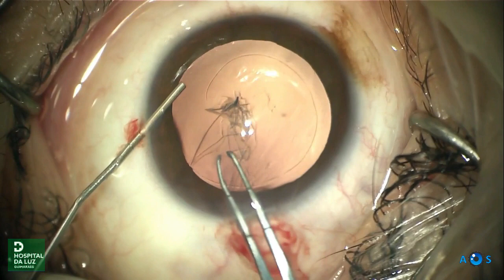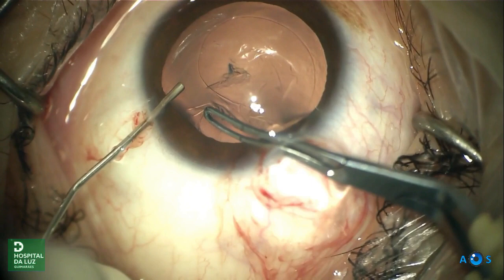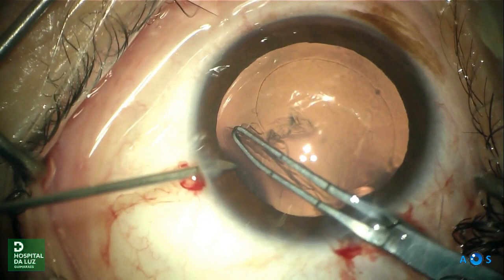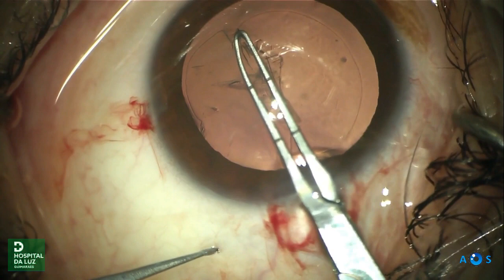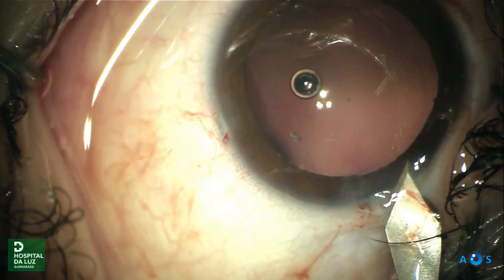Due to the anterior capsule elasticity, during capsulorhexis, a radial tear was observed, and we needed the help of a 25-gauge needle to finish this step. Uneventful lens aspiration was performed.